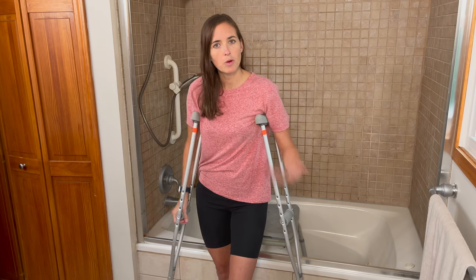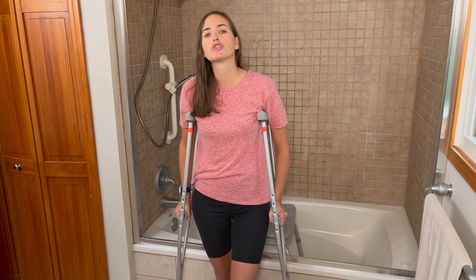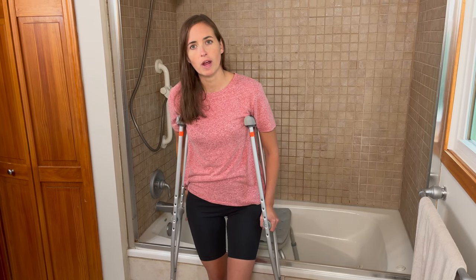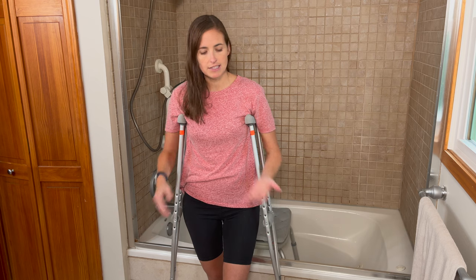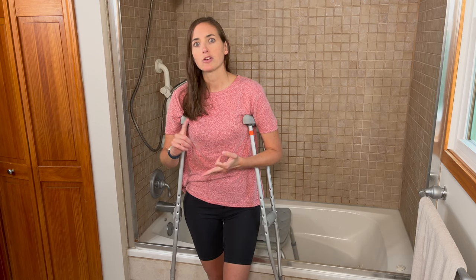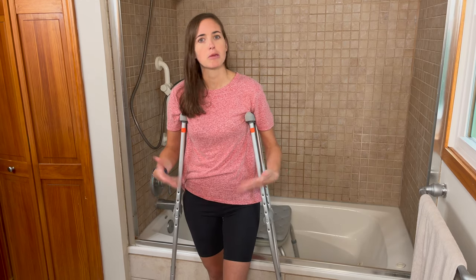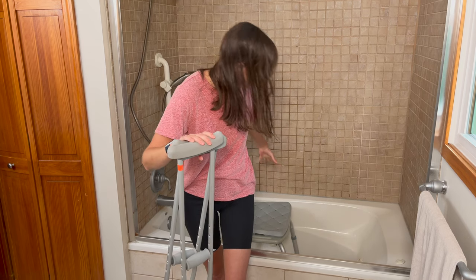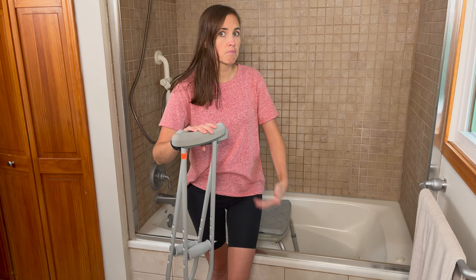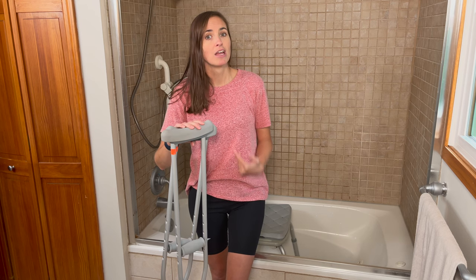So how would I transfer into the shower to complete my bathing? The first technique requires the most strength in your non-injured side. I'm going to be using crutches, but pretty much any mobility device — crutches, a walker, or a knee scooter — could all work for this particular transfer. I'm going to position my shower chair behind me. The nice thing about having no arms on the chair is I can sit from the edge of the tub back onto the shower chair, though it requires a lot of leg strength to lower myself down in a controlled manner.